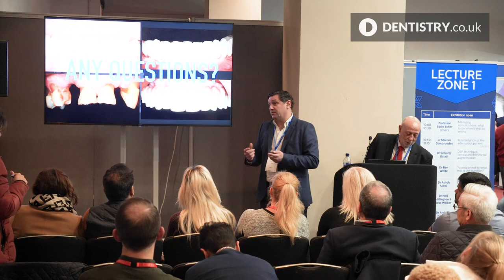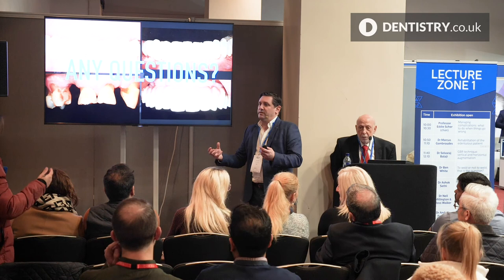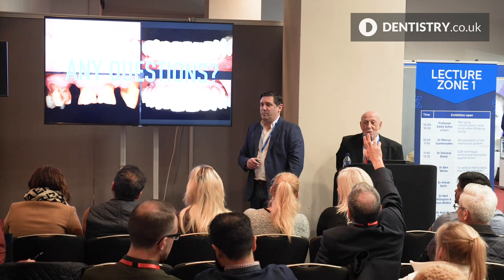Well, you could still do that. We don't routinely do that, so you could still remove it. You could take the crowns off. It's a bit of a faff. You would have to take the crowns off, remove the bridge, and then put it all back together again. But they should be able to access it to be able to clean it without having to remove it. I mean, you can obviously remove it, but it's a bit of a faff, to be honest.